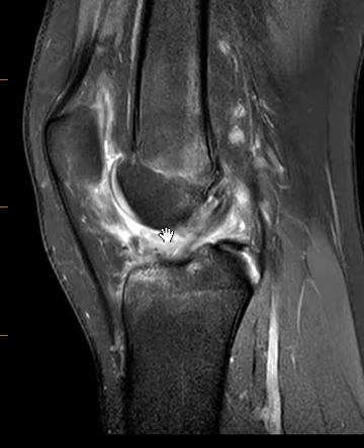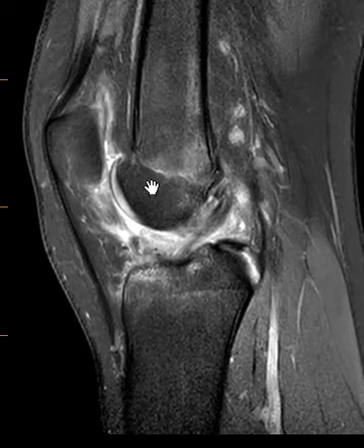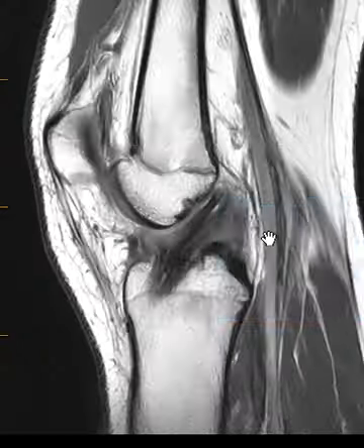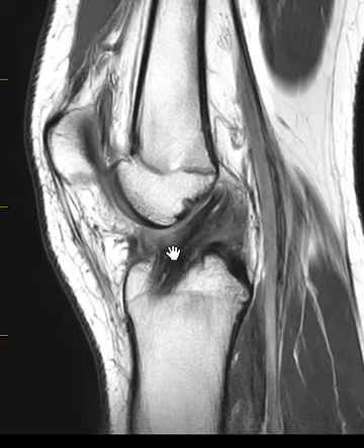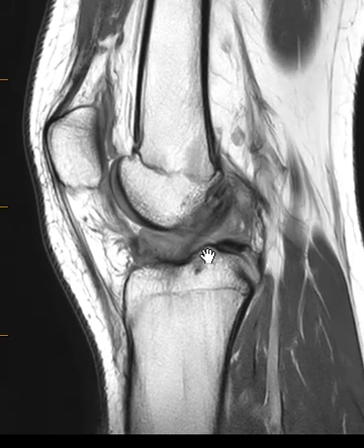But the main finding is here in front of the graft. There's this area of mixed signal intensity on this PD-FATSAT sequence in the front of the graft. We see this on the T1 images very well — right here, this mound of gray intermediate signal intensity. And this is arthrofibrosis.